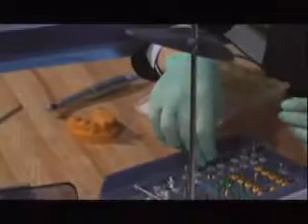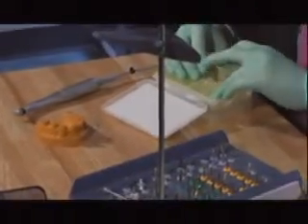Now something has to cover the top of the implant. Our options are a cover screw or a healing abutment. In this case, we're going to use a healing abutment that allows the gum tissue to form around it.